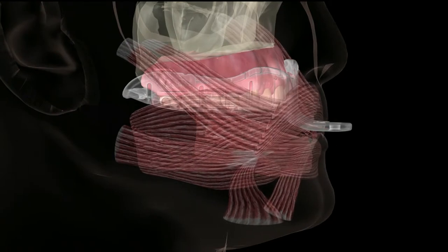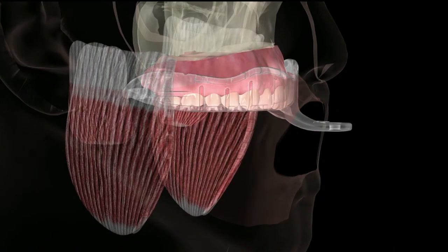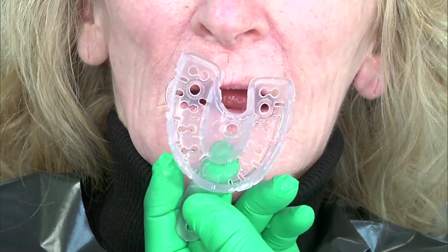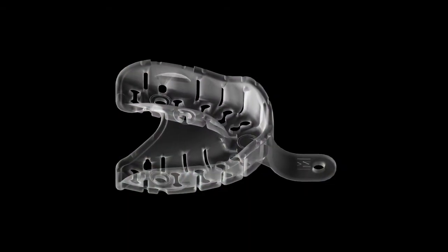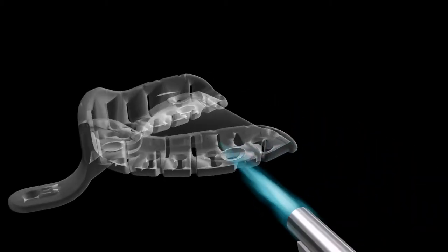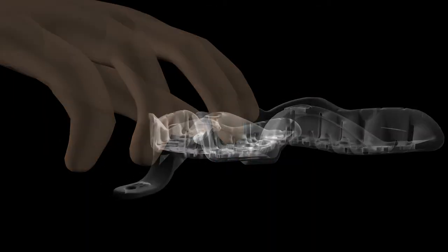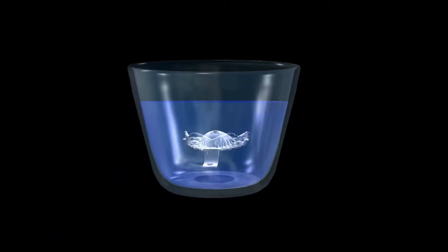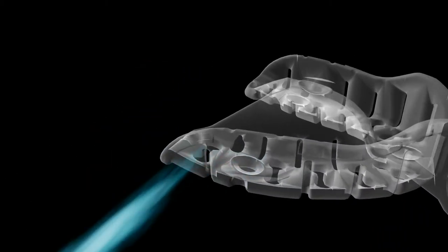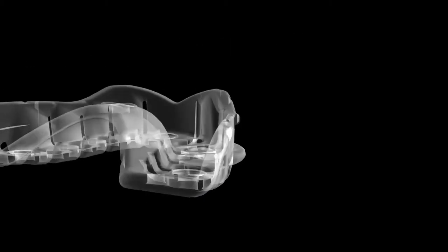The tray begins to stiffen very quickly, usually within 15 seconds of removal from the water bath. Time is critical to gain the desired results of a well-fitting tray. If the operator deems it necessary, small modifications can be made outside the mouth in some cases by flaming specific areas of the tray to further shape it, then chilling the tray in cold water to re-harden. It is important not to overheat or burn the tray if using a flame outside the mouth for additional shaping.